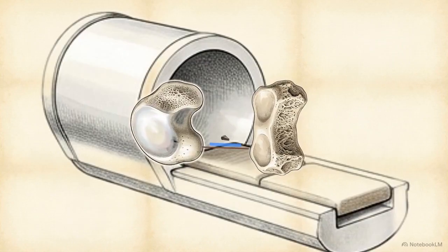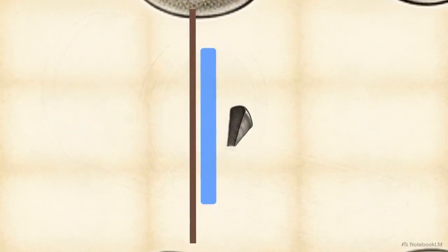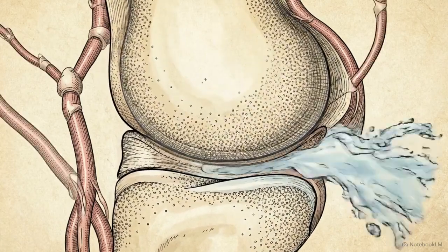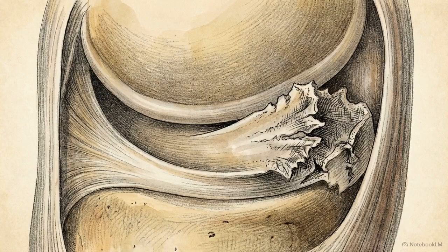As the joint extends, the posteromedial architecture physically compresses. The space between the medial femoral condyle, the capsule, and the meniscus clamps shut. This compressive force prevents synovial joint fluid from pooling dependently within the meniscocapsular separation. Because the MRI scanner's physical constraints squeeze out the joint fluid, the most obvious radiographic sign of pathology is masked. Radiologists cannot rely on the presence of fluid. They must evaluate secondary morphological markers.